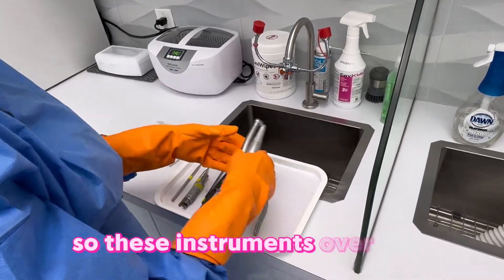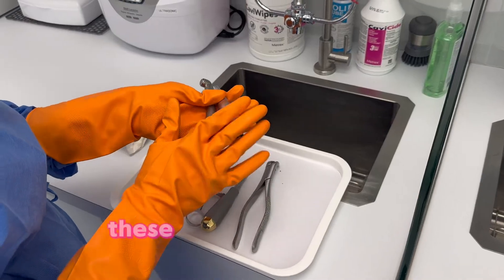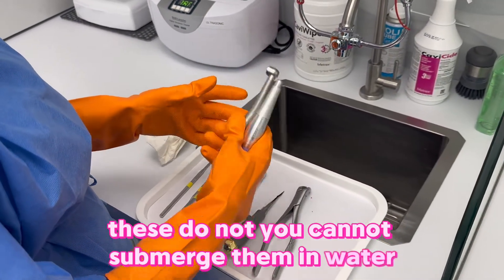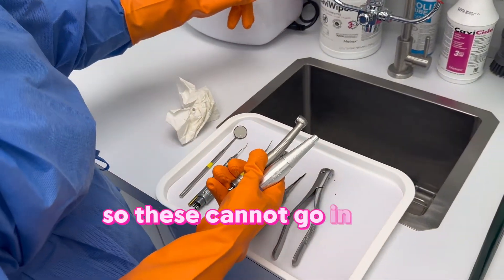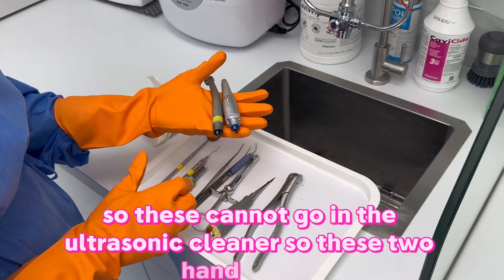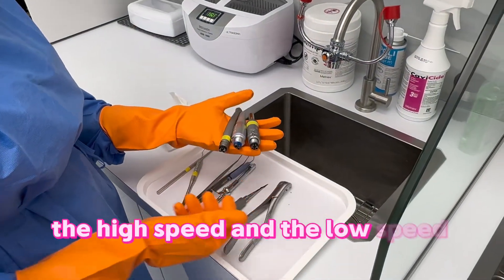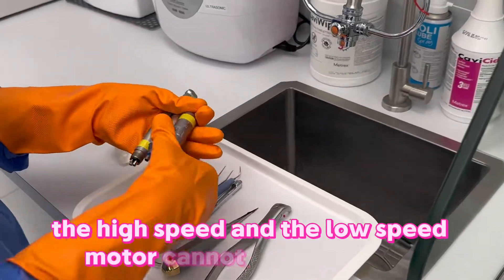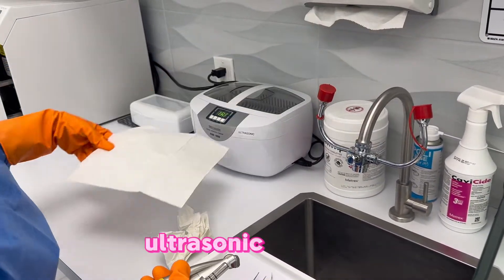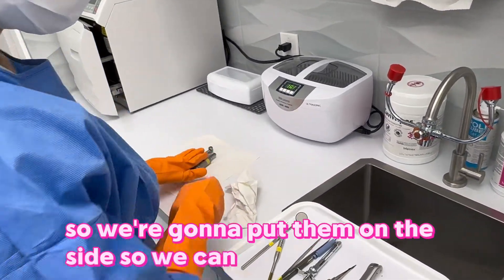These instruments over here are motor instruments — you cannot submerge them in water, so these cannot go in the ultrasonic cleaner. The hygiene handpiece, the high speed, and the low speed motor cannot go into the ultrasonic cleaner. We're going to put them on the side so we can wipe them down.